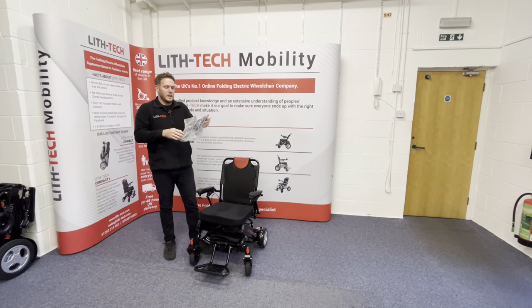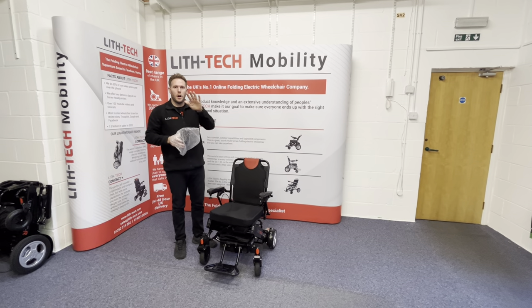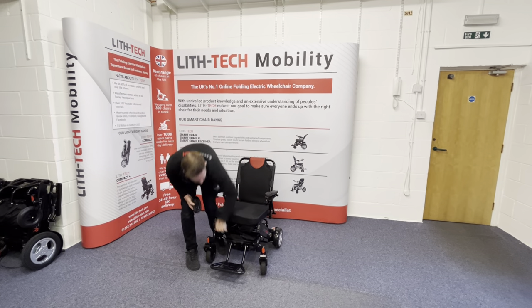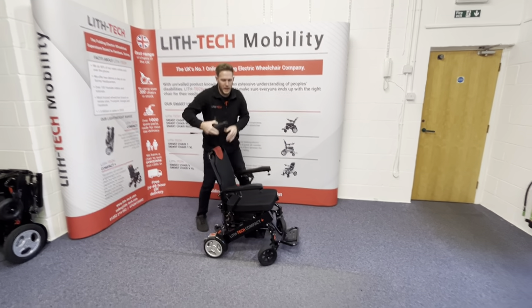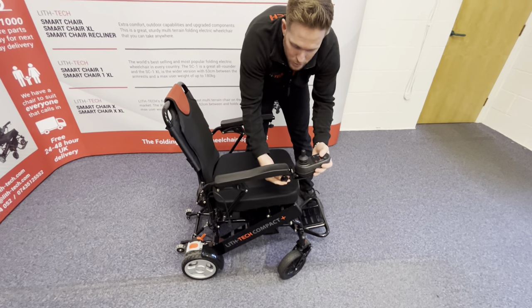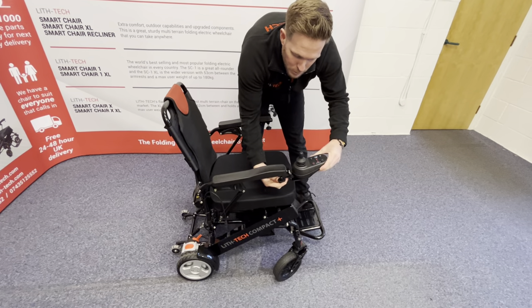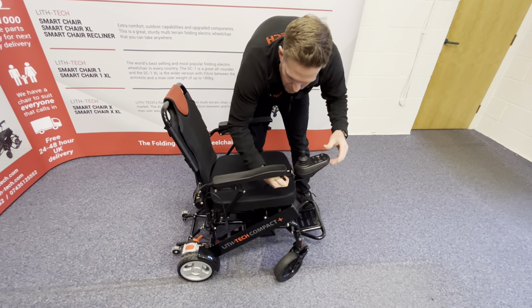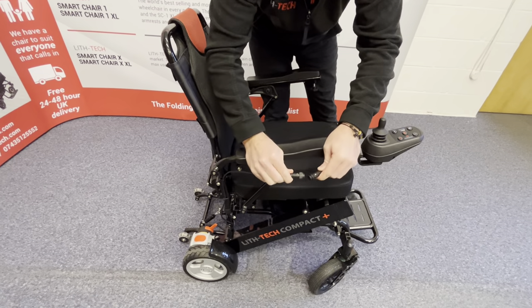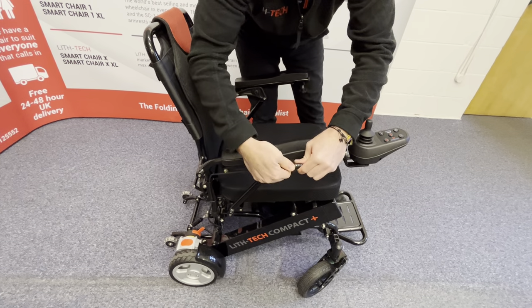Same as all our other chairs, it's electromagnetic braking — the minute you take your hand off the joystick, the chair will stop whether you're on an up incline, a decline, or on the flat. To attach the joystick: it can be on either side for a righty or a lefty — just let us know at point of purchase. If you've got a longer grip you can have it further out; shorter grip, further in. Line up the white arrows, push in, and twist to make a secure connection.